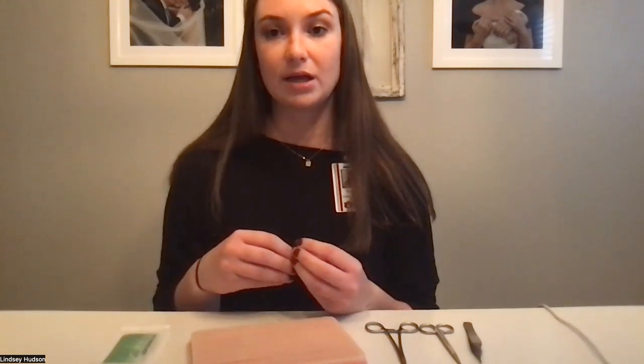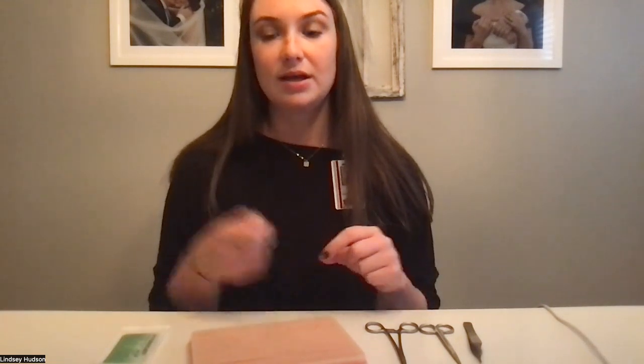So the things that you can think about are what type of sutures to use and how long to keep them in. So we have an absorbent suture and a non-absorbent suture. The absorbent suture you would use inside the body, like if the patient just had a C-section, you're using the absorbent sutures so that you don't have to go back into that incision and take those out of the uterus, it's just going to dissolve. For this, since it's on the outside of the body, we're going to use a non-absorbent suture.